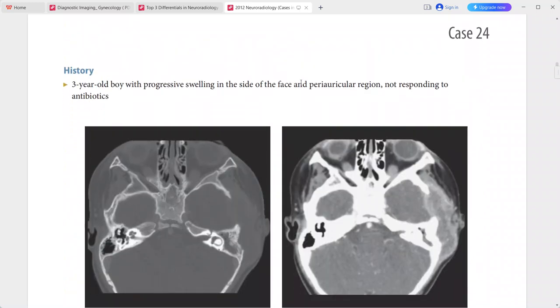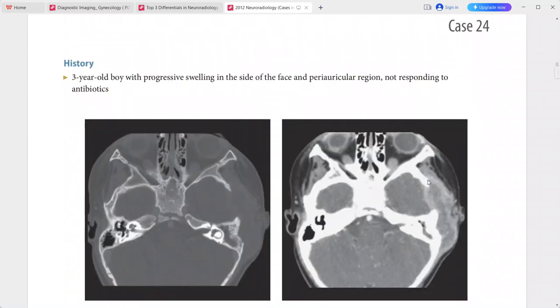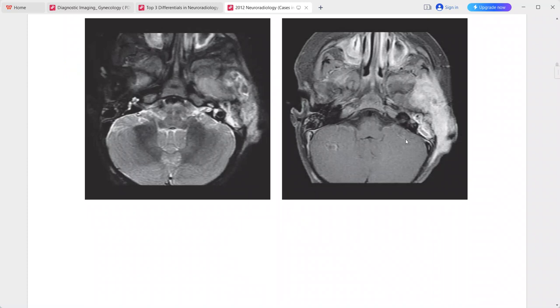Next case: 3-year-old boy with progressive swelling in the side of the face and periauricular region not responding to antibiotics. CT shows a destructive lesion of the left temporal bone with well-defined bone margins and an associated enhancing soft tissue mass. The left mastoid air cells are opacified. MR images show a heterogeneously enhancing mass, mostly hyperintense on T2, within and superficial to the left temporal bone.